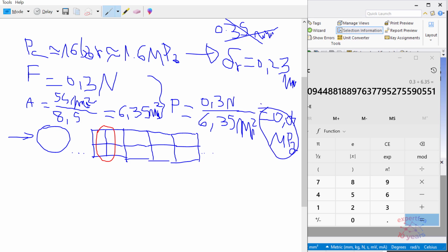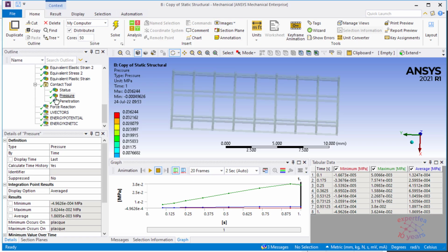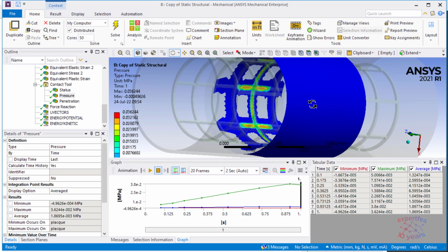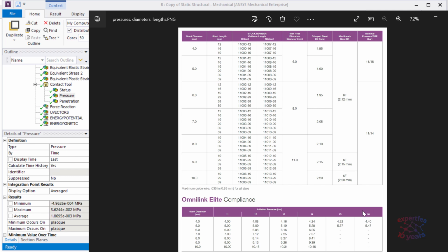This value needs to somehow be compared with this value, and yeah, the results are not nearly close. So this value 0.04 megapascal can be seen on the contact pressure, it's close to what we have here, around 0.04. So our judgment is, let's say, correct. Only we don't have a proper correlation with these 1.6 megapascals from the inflation pressure.